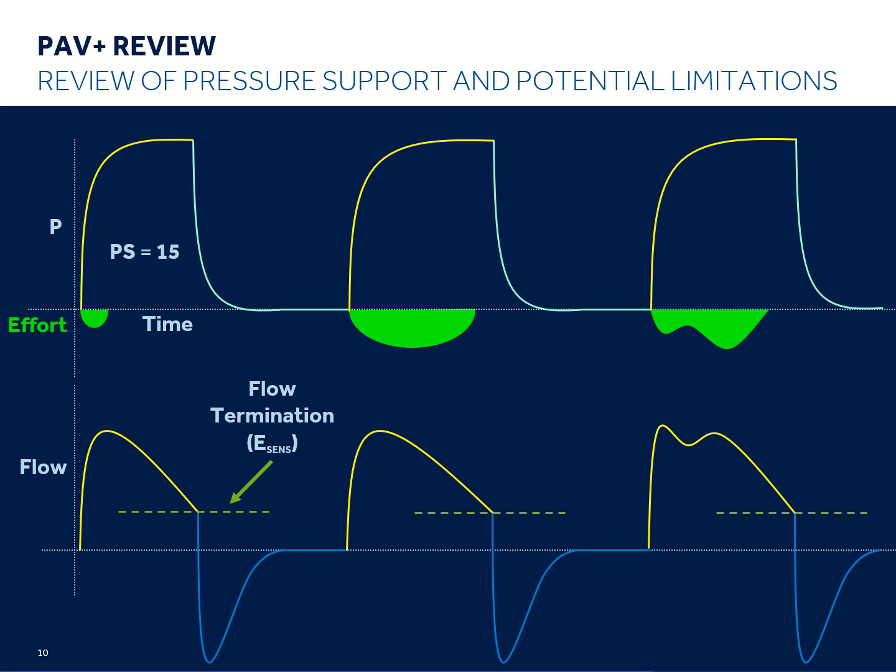Notice that on the first breath, a tiny inspiratory effort, or even a strong cardiac oscillation, can trigger the breath and potentially generate a significant tidal volume. I've personally witnessed heartbeats trigger pressure support and result in tidal volumes of 400 mils, 500 mils, or even higher, depending on pressure support setting and patient compliance and resistance.